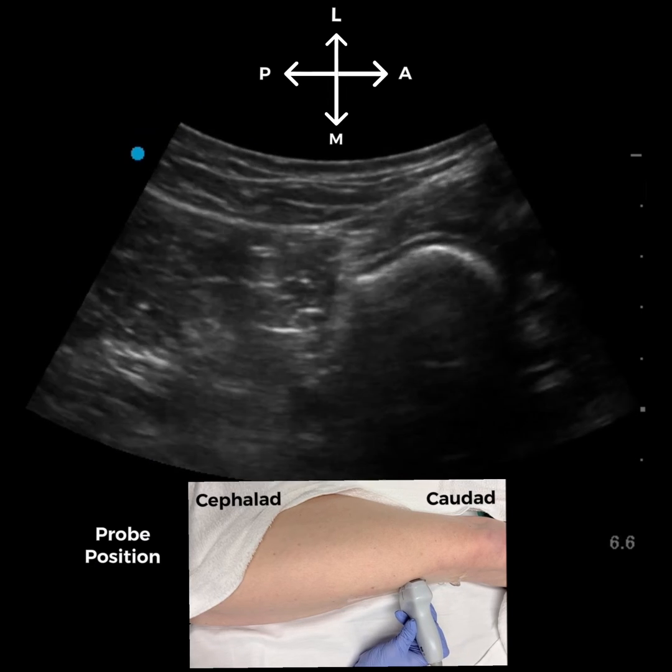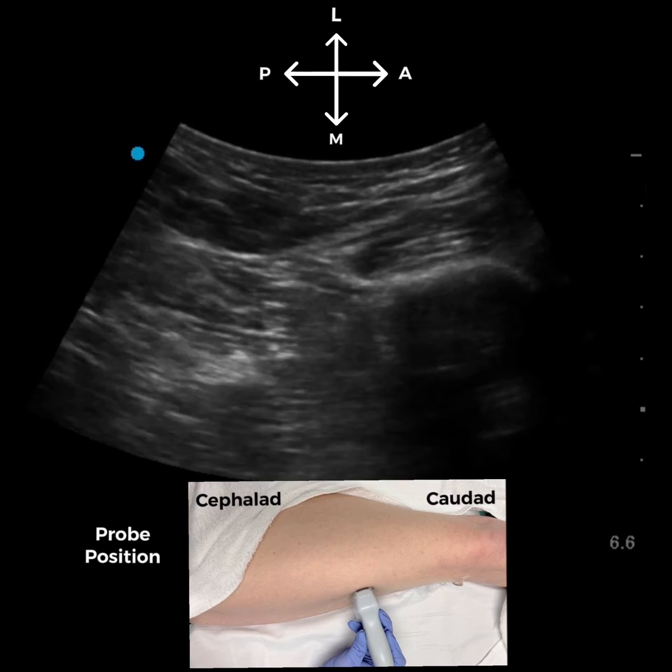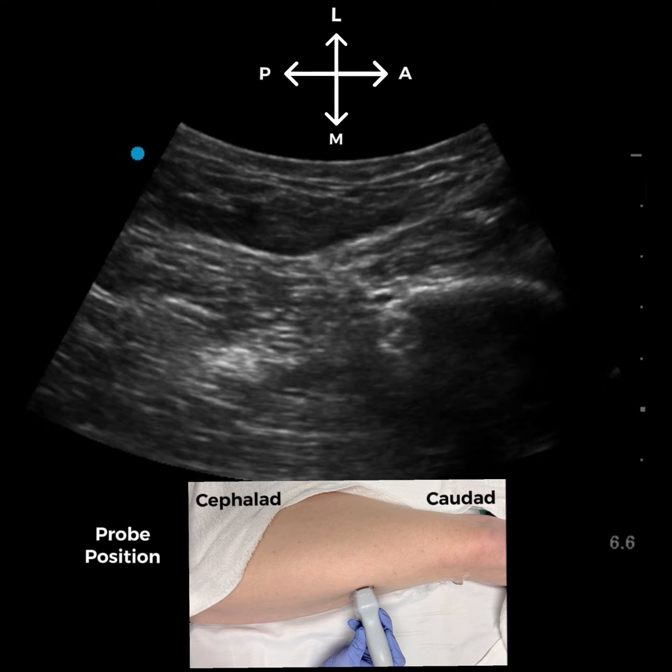We can complete the lateral approach to the sciatic nerve block at this level, although it's my personal preference to scan a little higher to make sure I've blocked the nerve proximal to its division into the tibial and common peroneal branches.